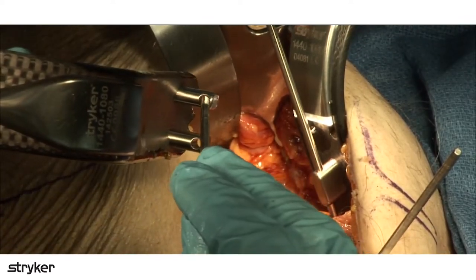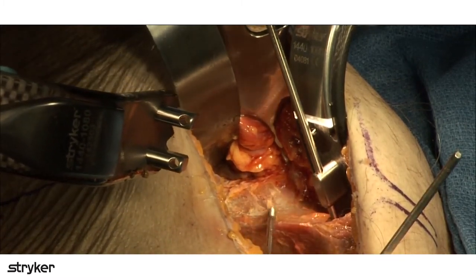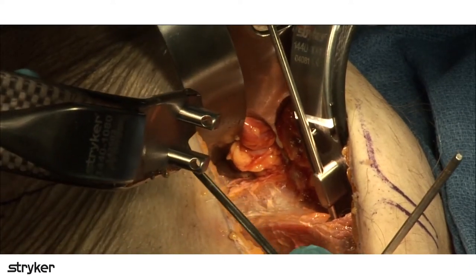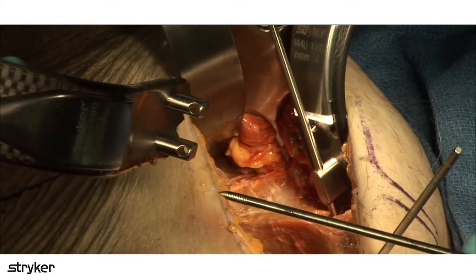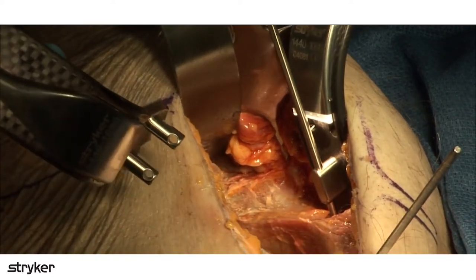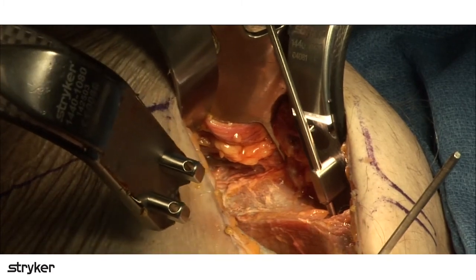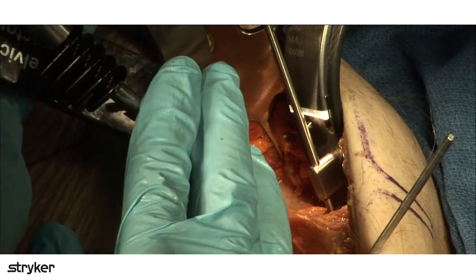And the reason for that is that when it comes time to putting the brim plate on here, it doesn't matter what type of plate you're using, any brim plate that goes along here, if you're in this one here, sometimes that wire will interfere with your ability to put a brim plate on. So it's nice to use the more lateral of the 2 options to help retract that and not have a K-wire interfere with your ability to look in on that. All right, so I'm going to slide this up just lateral to the sacroiliac joint.